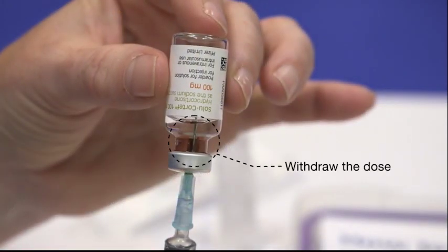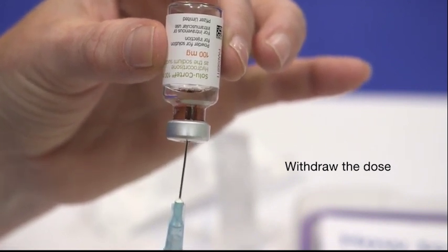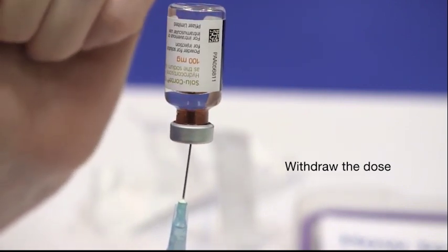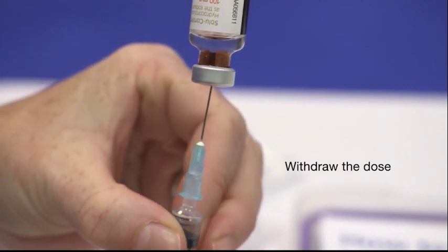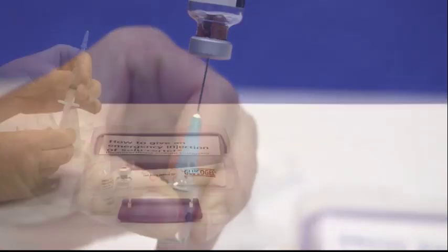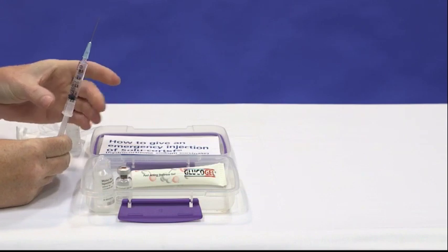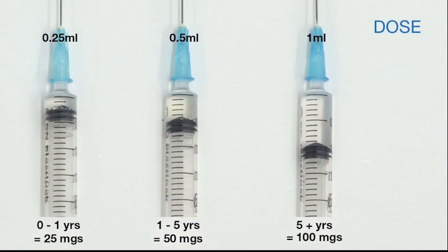Don't shake the bottle — otherwise you get lots of bubbles — just stir it. Then you're going to withdraw the needle into the window on the rubber bung. Keeping the needle pointing upwards, withdraw the needle until just the tip is in the window, and then withdraw all of the medication. Then again remove your air by keeping the needle pointing upwards, giving a tap on the black plunger and pushing it through until it comes to the tip of the needle. Your doses are again quarter of a mil for under ones, half a mil for one to five, and a whole mil for five plus.